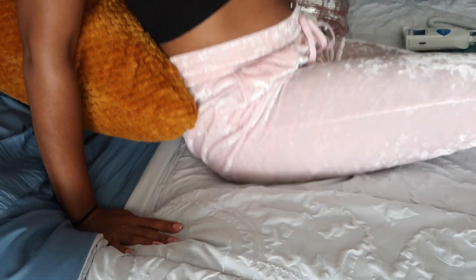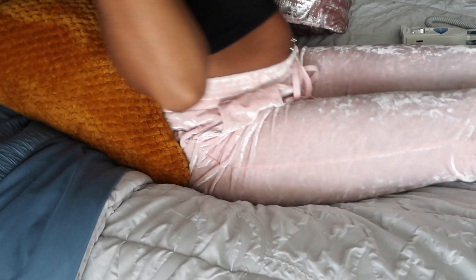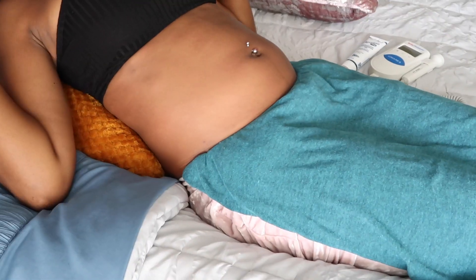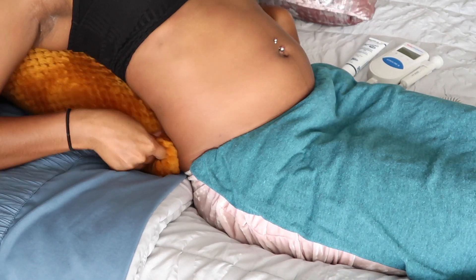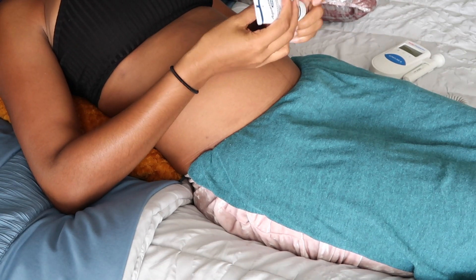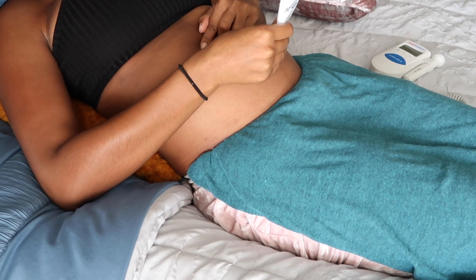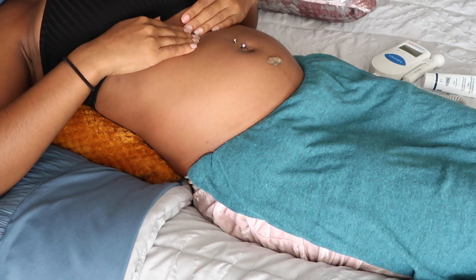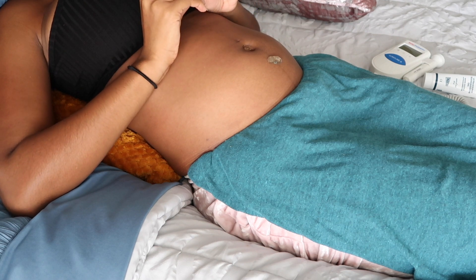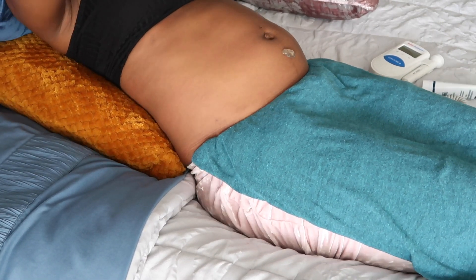First of all, you just want to find a comfortable position — put some pillows behind your back and figure out what feels right for you. Once you're comfortable, take your gel and put it right on your stomach. If you have any belly jewelry, it might be easier to just take it out at this point. I'm not super far along to where my skin is stretching too much, so I'll just take it out for the purpose of this video.